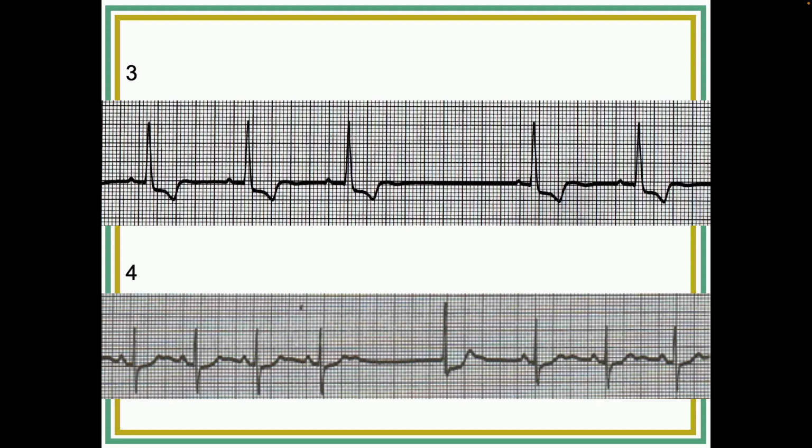There's 2 intervals there. So you could go 10, 20, 30, 40, 50, and then there's a little bit on either side. So it's somewhere between 55 and 60. This one, I think, is kind of a hard one to use the 6-second because you're going to have to calculate for the underlying rhythm, this is 3 times as much and so forth.